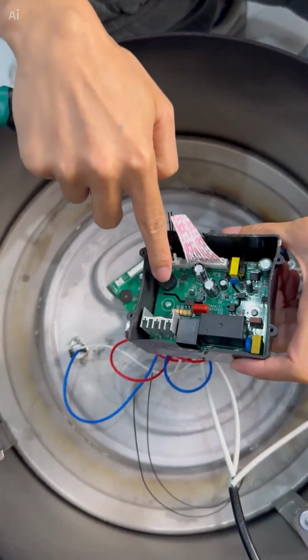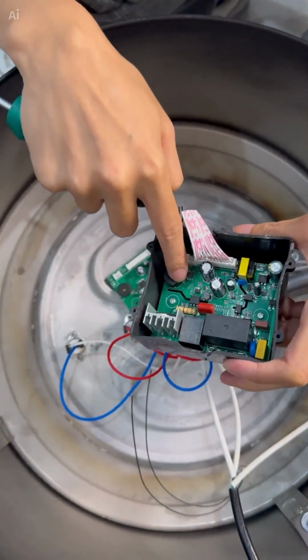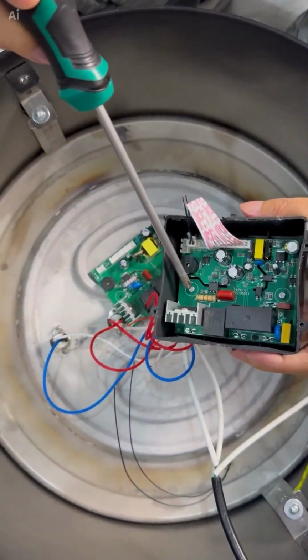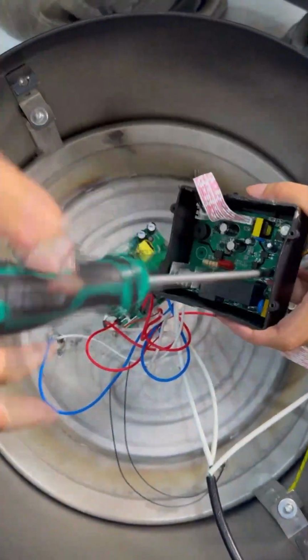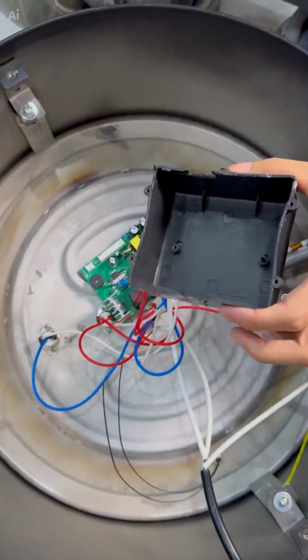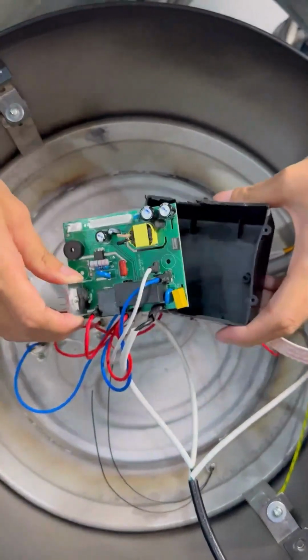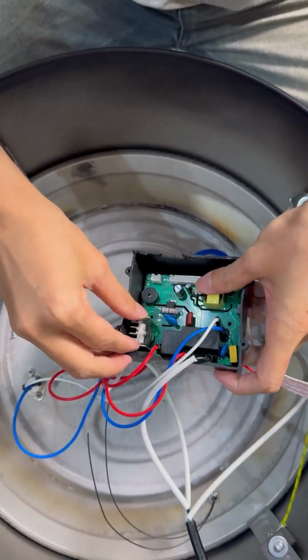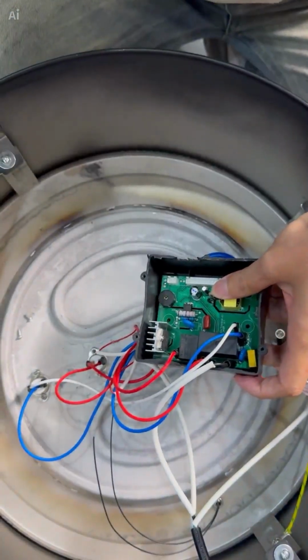Take out the old power circuit board, then remove the old power circuit board and install the new one into this black box. Okay, mainly remove these 2 screws here. Okay, the old one can be set aside, then install the new one. Then align the holes on both sides, and once aligned, you can install it.